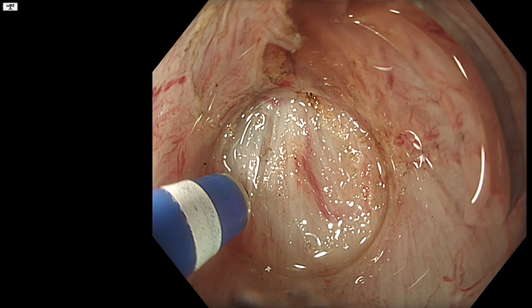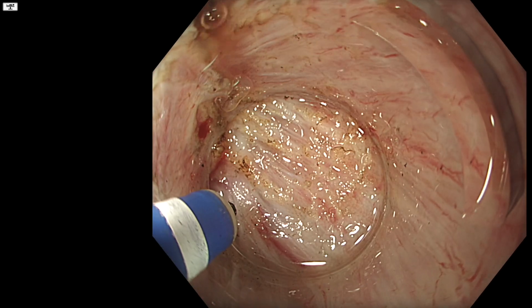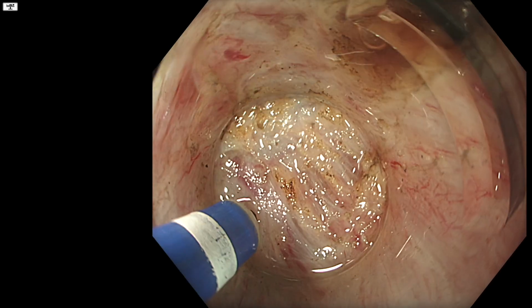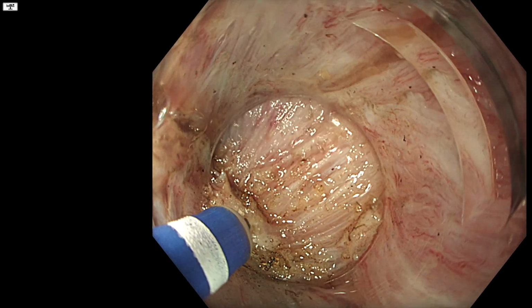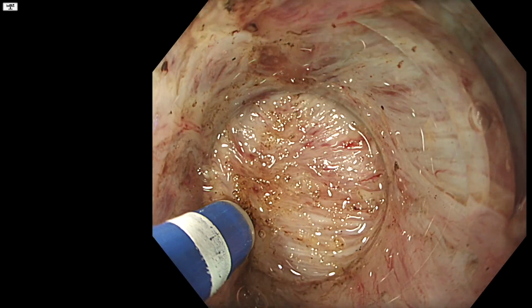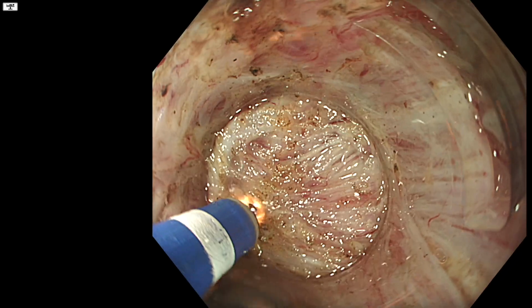So really only 53% were true deep T1 cancers, which are the intended target of EID. But the crucial point is that in every single case, EID provided definitive histological staging that optical diagnosis and MRI simply cannot, and that staging information is what ultimately is going to drive every management decision that comes next.